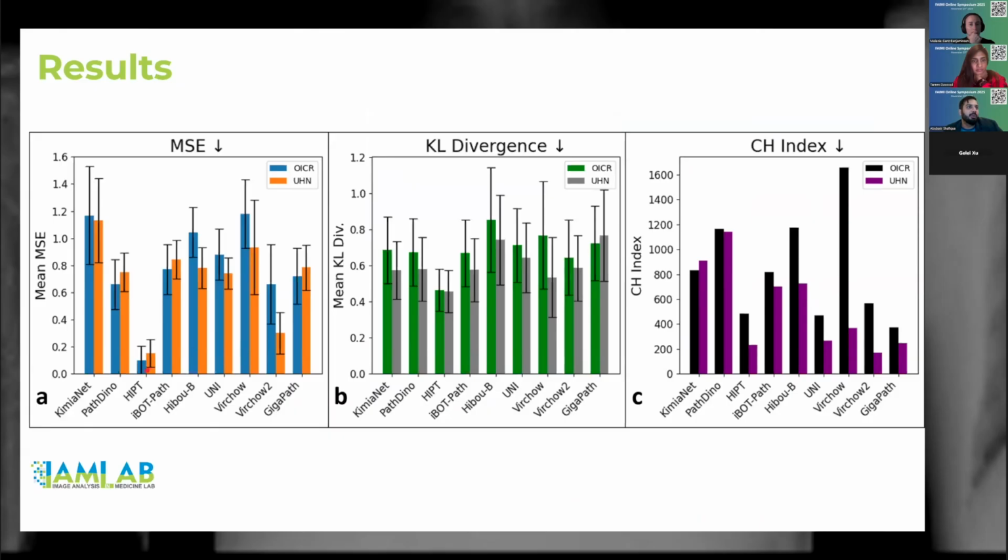As we can see, some of the models, like HIPT, have the lowest feature difference, and even the foundation models have some kind of feature difference as computed by the mean square error. One of the reasons to compare with the mean square error is that it is not dependent on the length of the vector, so we can compare different models together, as each model generates a different length embedding vector. In other metrics like KL divergence, we can see the distribution comparison of the feature distributions, how they compare with each other.